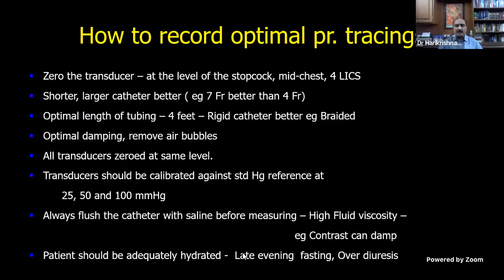Then you have to remove the air bubbles. I need not tell you, you must have done all those things. And if you have two transducers, both should be zeroed at the same level and both should be checked. For example, when you puncture the artery, you open both the transducers and show that both tracings overlap. Then only you are making sure that the level and the damping of the two transducers are the same.